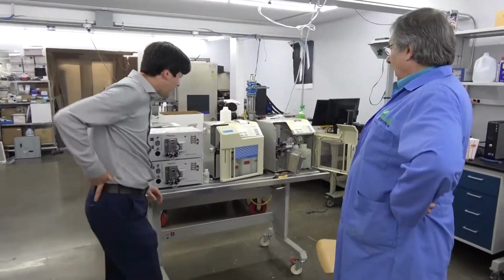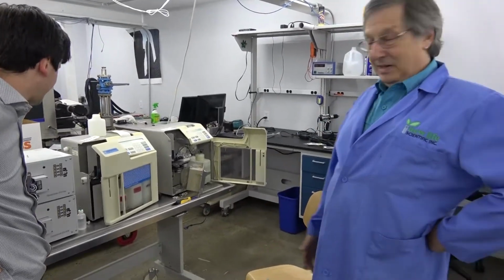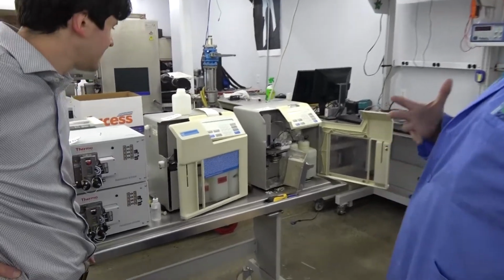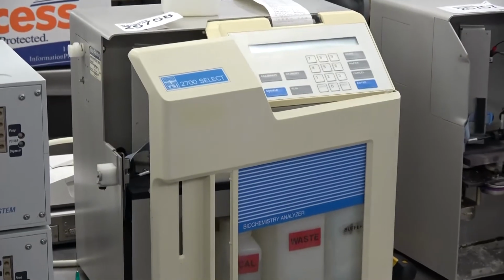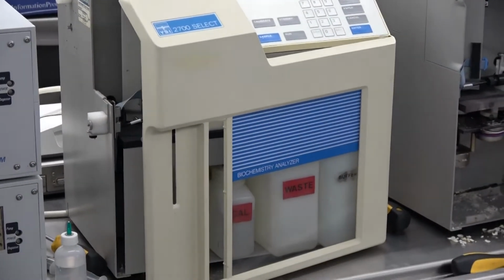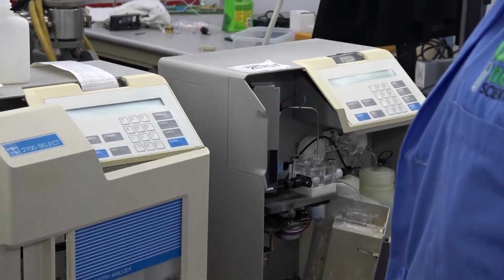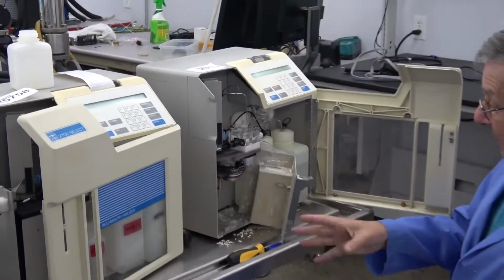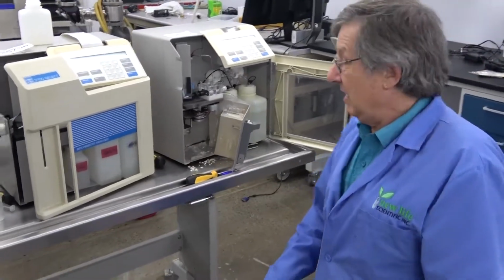What do you got? Well, these are, as you said, the Yellow Springs 2700 Select Biochemistry Analyzer. A classic. These are from '97, '95. We've moved several of them through here without a problem. Everybody seems to like them. I don't think they've changed much. They don't sell them anymore, but they haven't changed much, though occasionally we get them and they're kind of crusty. Yeah, crusty, that's the word.